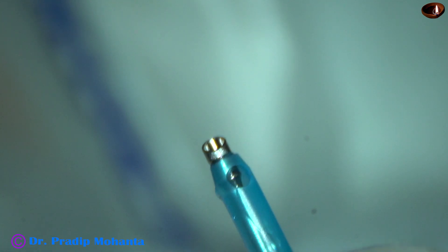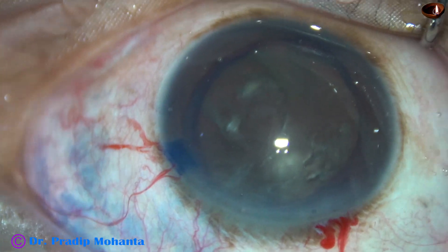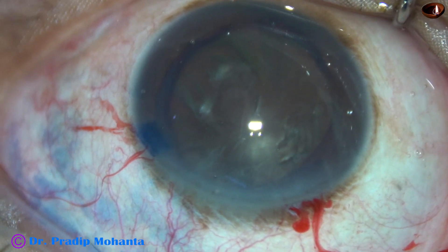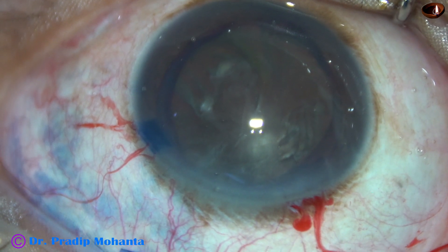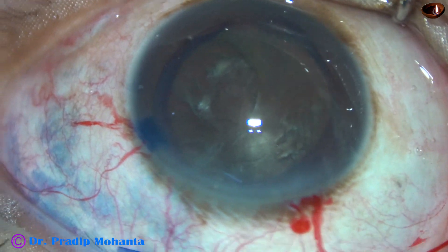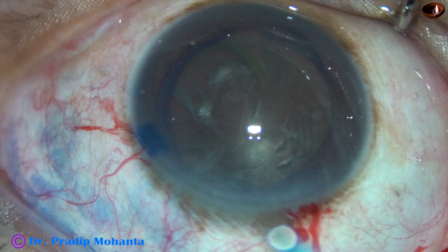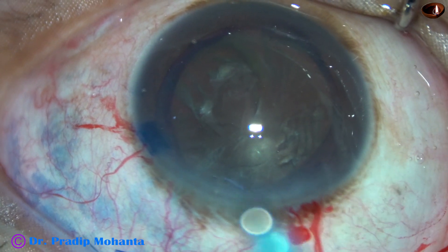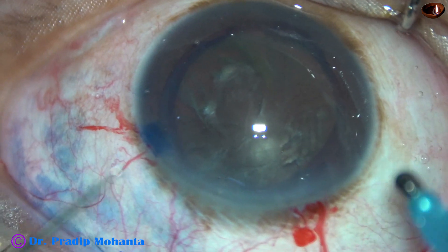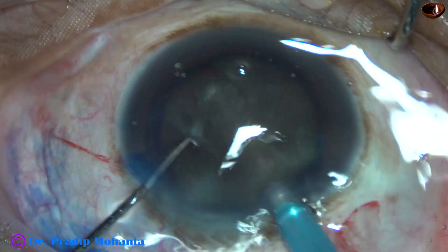The exposed part of the phaco needle is enlarged for managing this hard cataract. It is now time to introduce the phaco needle into the anterior chamber. Vacuum is 450, flow rate is 45, and ultrasonic energy is 90% in continuous mode.